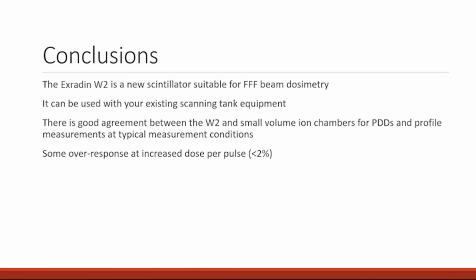Oh, definitely. Finding a detector for flash irradiation is always challenging. There's film and TLD, but that's not the instantaneous readout that you want when you're trying to make sure that you've got your flash dose rates right before your experiment. No detector is perfect, but if we do figure out the dose rate dependence that might be there and correct for it, then this would definitely be a contender, I believe. Sure.